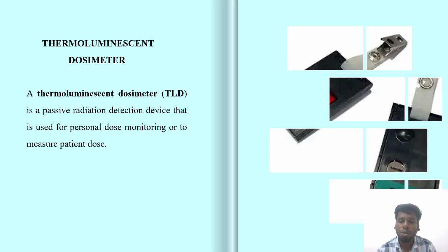It is widely used in radiology departments, nuclear facilities, radiotherapy centers and environmental monitoring. It works on the principle of thermoluminescence, which was explained before, where certain crystal materials emit light when heated after being exposed to radiation.